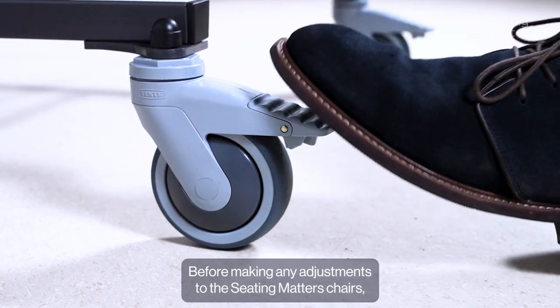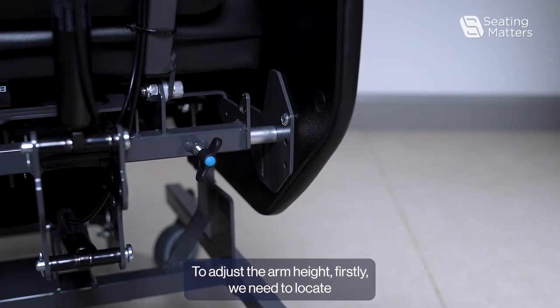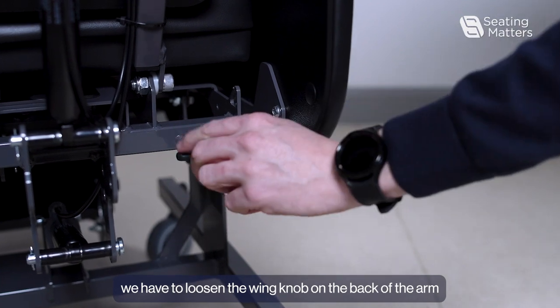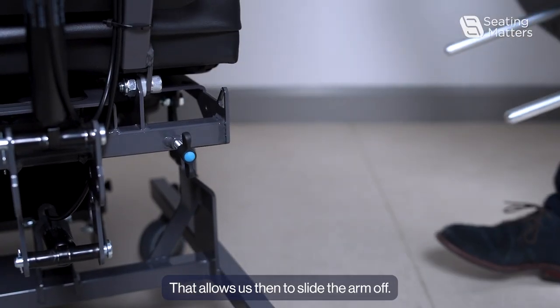Before making any adjustments to the Seating Matters chairs, lock the two brake casters at the back of the chair for safety. To adjust the arm height, we have to loosen the wing knob at the back of the arm and loosen the wing knob at the front of the arm. That allows us then to slide the arm off.